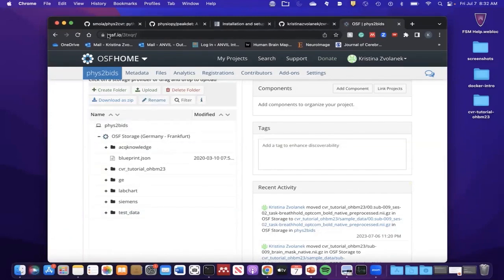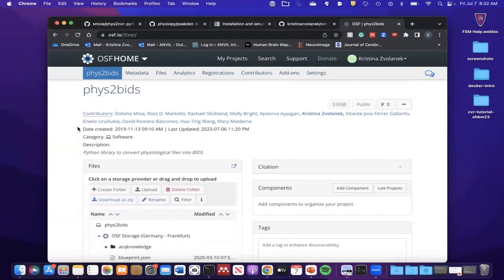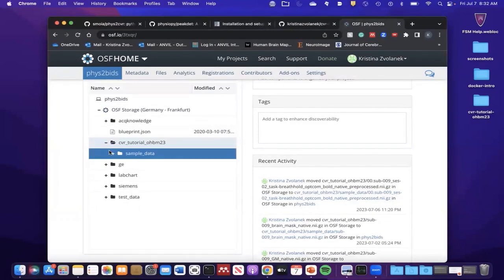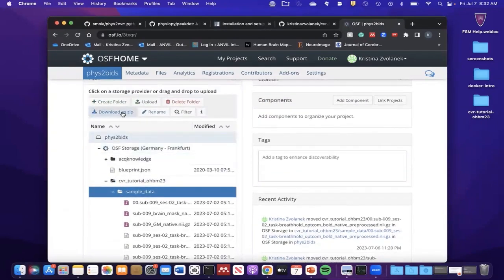Then one last setup item is to clone or download the code that I have prepared for the tutorial. So if you go to this repository on my GitHub profile, the link is, or the address is shown here, and the link is provided in the tutorial as well.